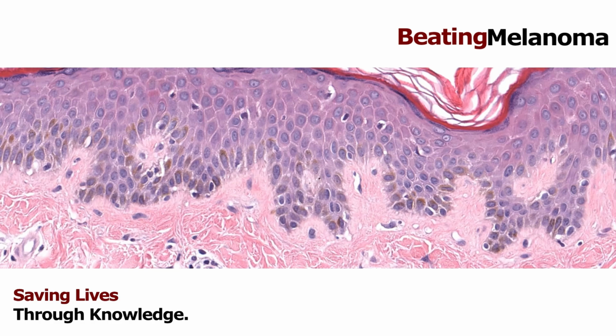That's the skin. Normally, the cells start down here, they grow up and go to the top, and then they undergo a programmed type of death that leaves behind this skeleton of keratin. And that's when you get flaky, dry skin and the dead skin flakes fall off. That's what's falling off, these loose bits of keratin up here. So this is normal.